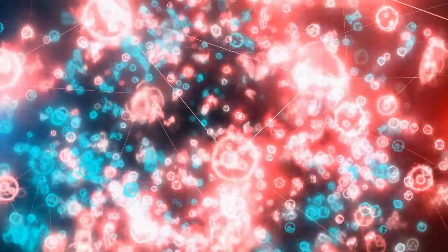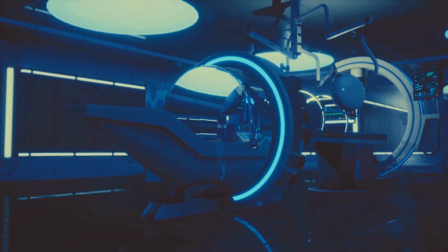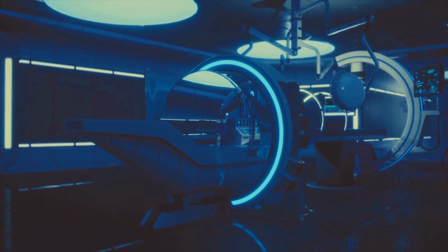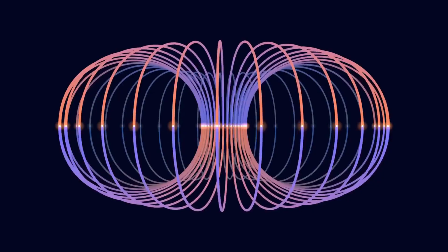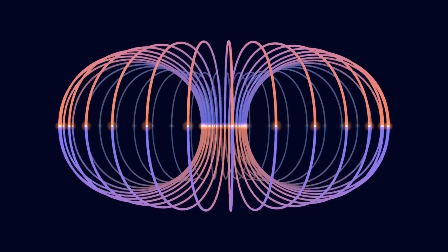Protons act like tiny magnets. Under normal conditions, these mini-magnets are arranged randomly. But when a person enters a strong magnetic field, like in an MRI machine, the protons begin to align in one direction, along the lines of the magnetic field. It's as if thousands of compass needles suddenly started pointing north. This alignment alone doesn't create an image.